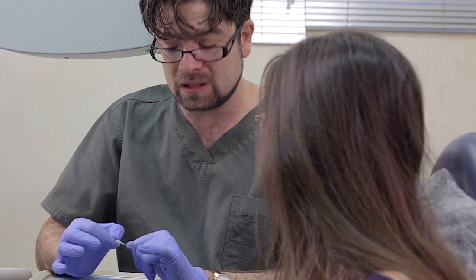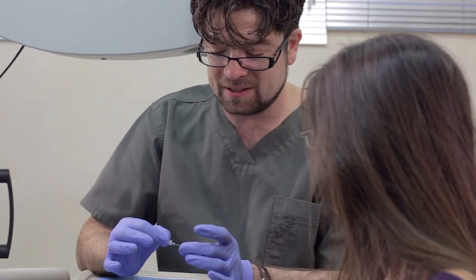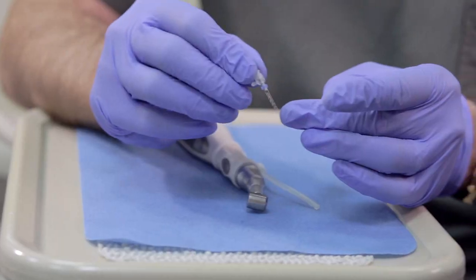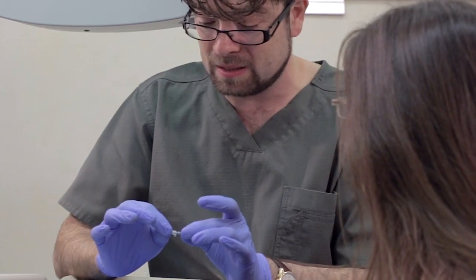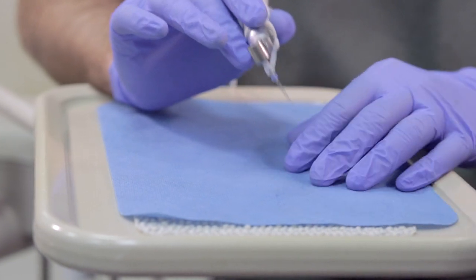The SAF mode of operation is unique and can neither be classified as step-back nor crown-down. This single file shapes, cleans, and disinfects the entire length of the root canal simultaneously.